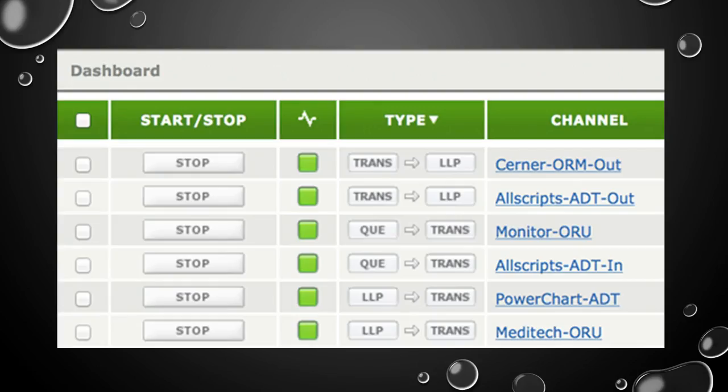This is what an interface dashboard will look like. The green lights in the center indicate everything is good. If one of them had turned red, where it says stop would then say start. You would click next to it, click start, and that would restart the interface.